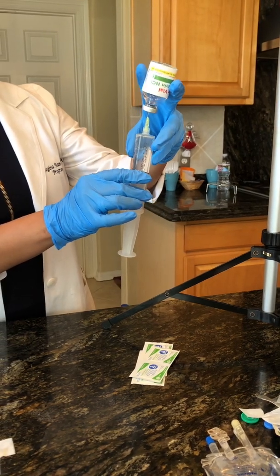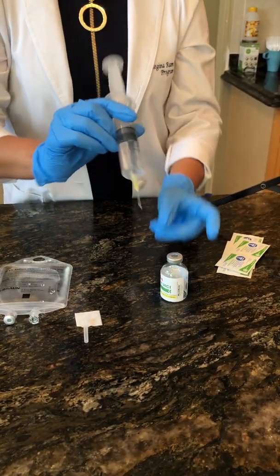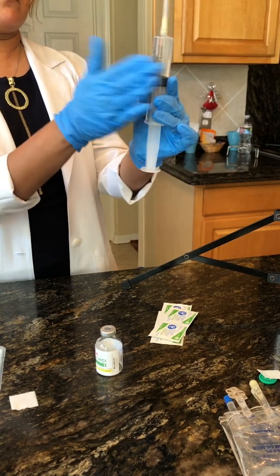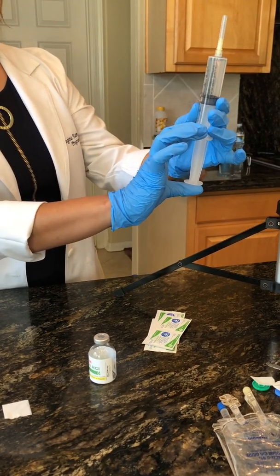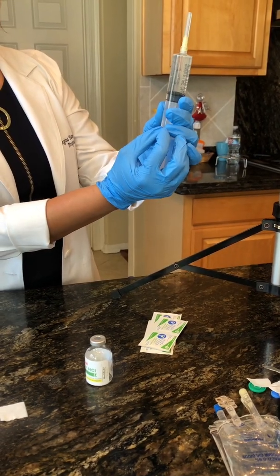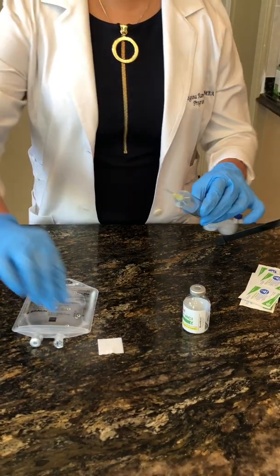You don't want to leave the vial like that — tap and remove some bubbles to make sure you have at least how much you're desiring. Put this back down and remove. Cap this, and tap the remaining air bubbles out. Pull down to remove excess liquid from the hub, and go ahead and push up. In this case, I'm not really concentrated on having it exactly at 20 cc's — the reason being I need the full gram. Once I've removed all of the air bubbles, I'm ready to shoot this back into my bag.